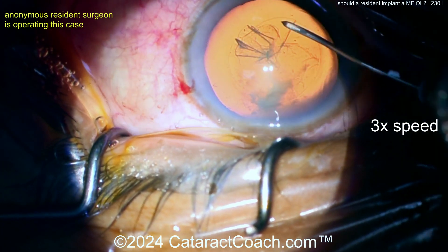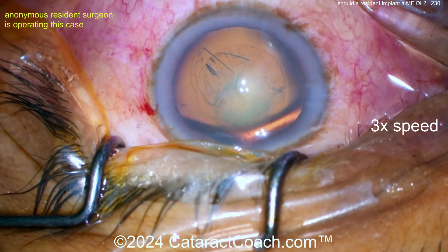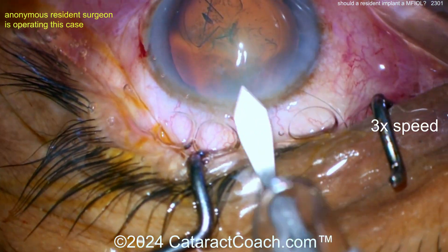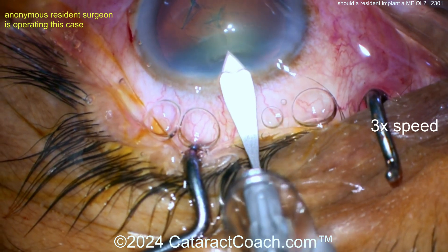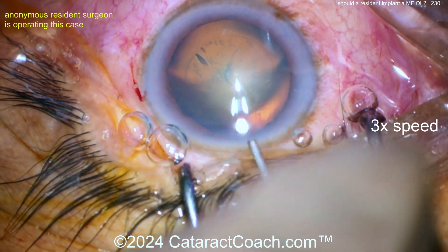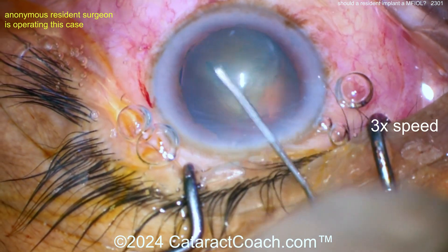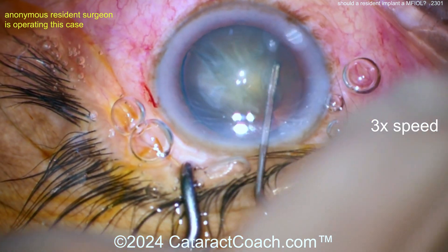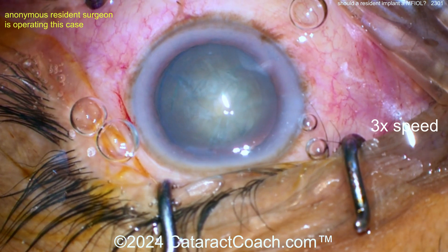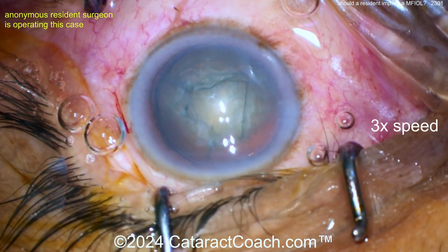This is pretty good for less than 50 cases — that's really good. The rhexis was done with just a syringe through the side port. Here's the main incision; moving the speculum over a little bit — I like the incision. Now for hydrodissection: not too dense a cataract, which is a good thing. There's the nucleus — a reasonable amount of nuclear sclerosis. The nucleus spins — great. More viscoelastic going in; let's see the nucleofractis technique.